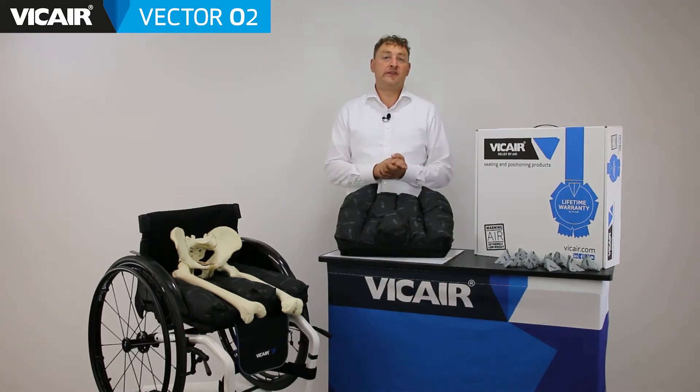Hello everyone and thank you for joining me. In this video we will be talking about the Vicair Vector O2 wheelchair cushion. We will discuss its features and applications.